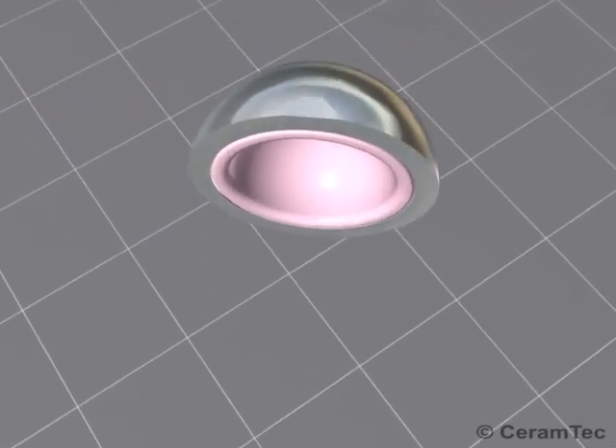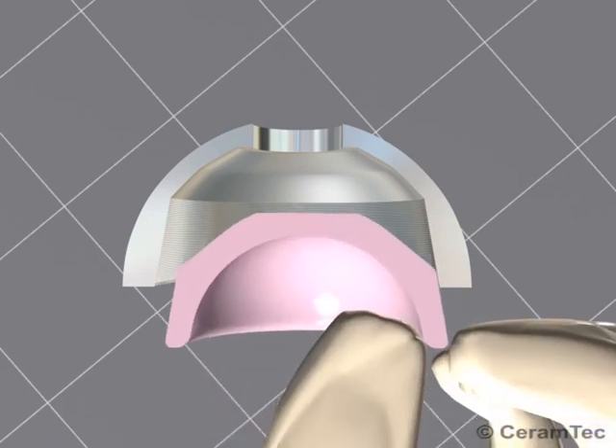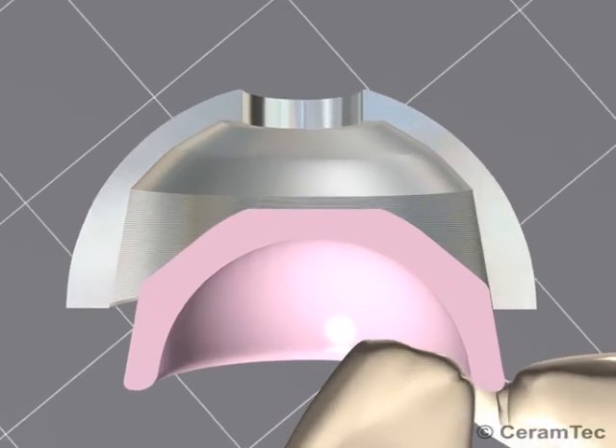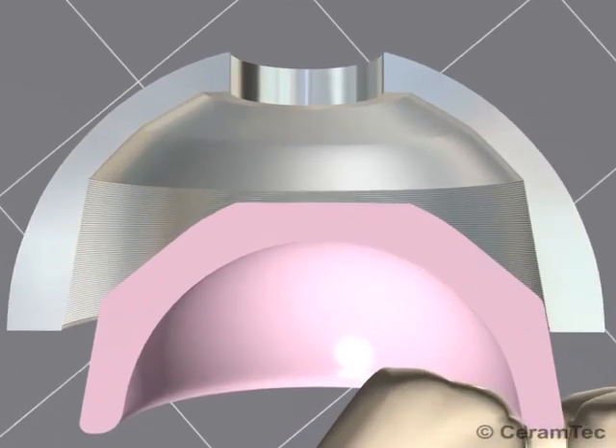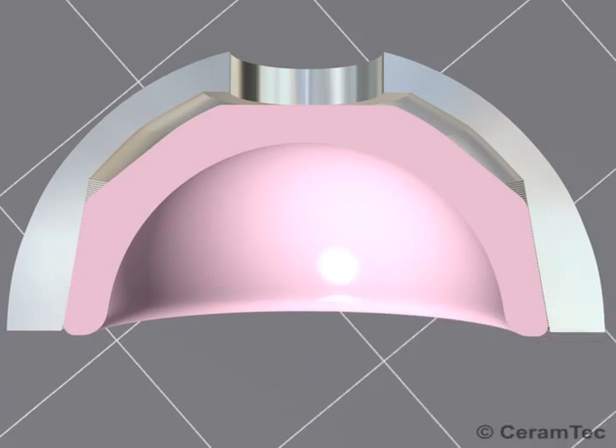Modern hip replacements consist of a modular system in which the acetabular cup consists of a metal shell and an insert. The inside of the metal shell has a special surface structure. This special taper fixation ensures secure clamping to the insert while allowing for the possible intraoperative replacement during primary surgery or revision surgery.